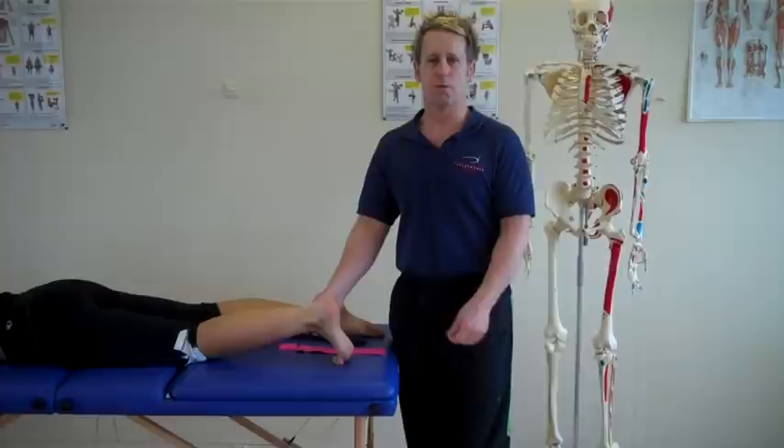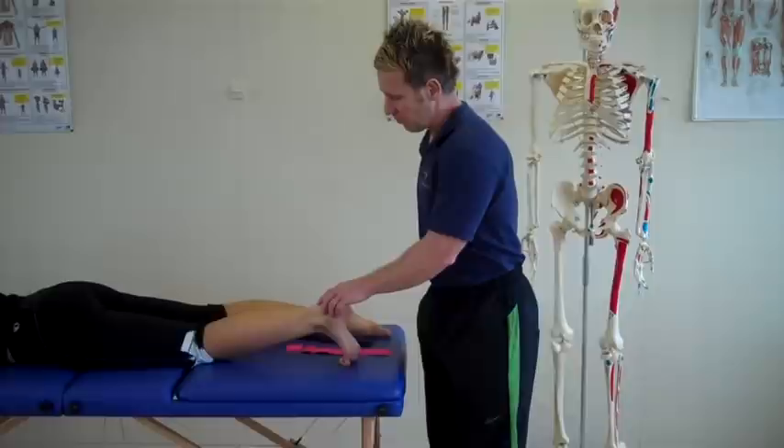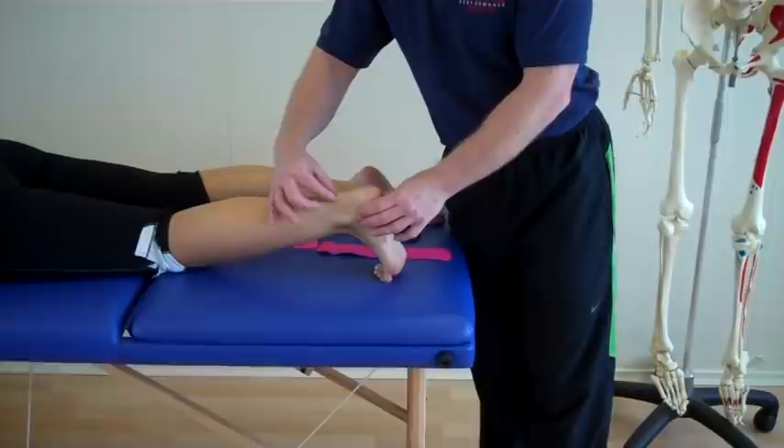Hi, my name is John Gibbons and today we're going to look at a patient who presents with Achilles tendinopathy and we're going to use functional tape to help for the pain. I've marked an X where the patient will present the pain, which is commonly this lower aspect of the Achilles.